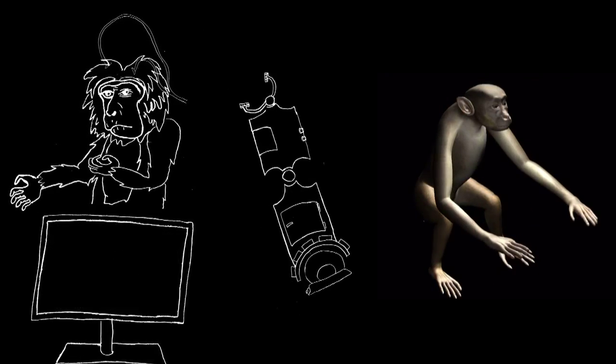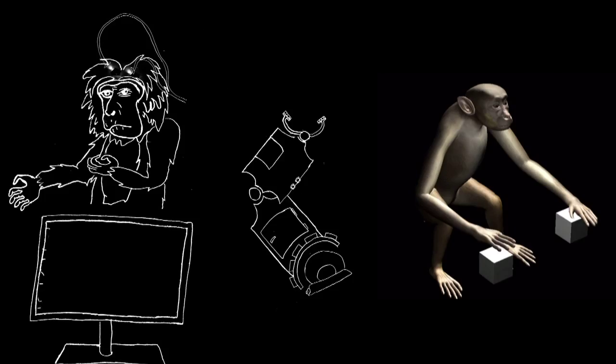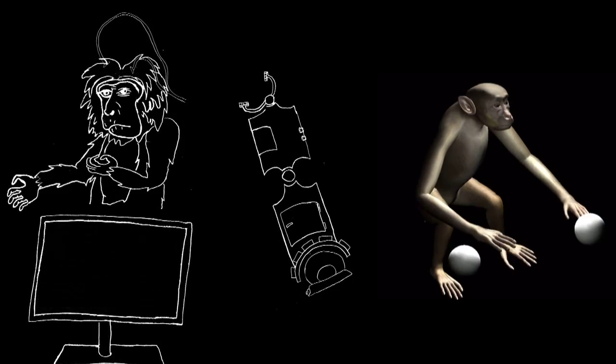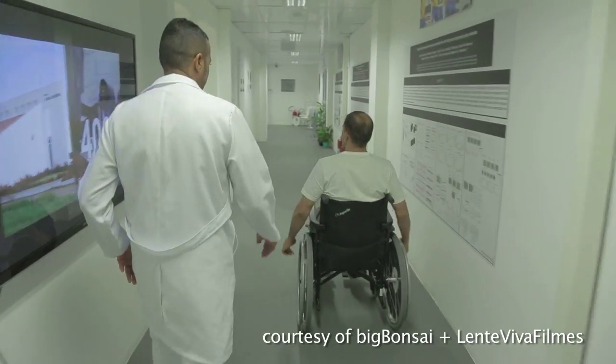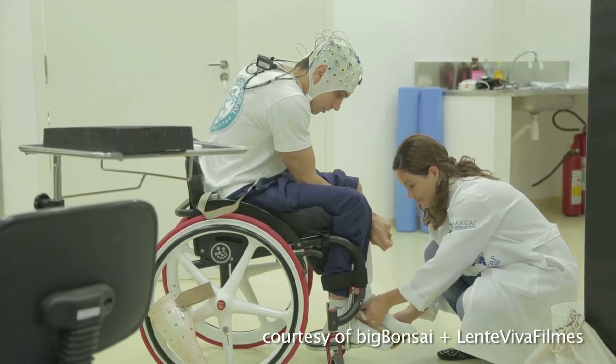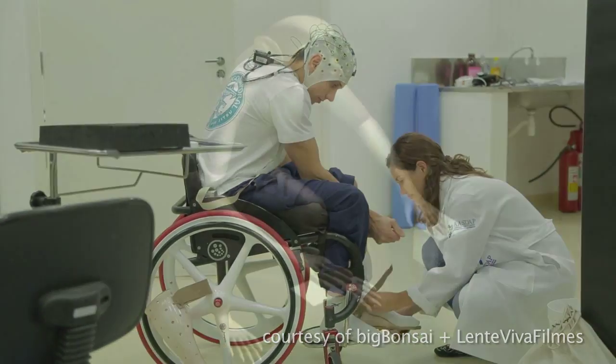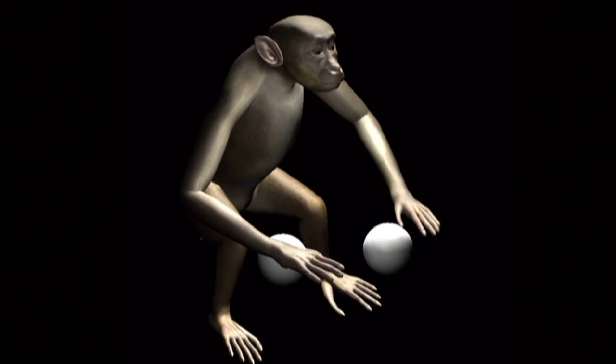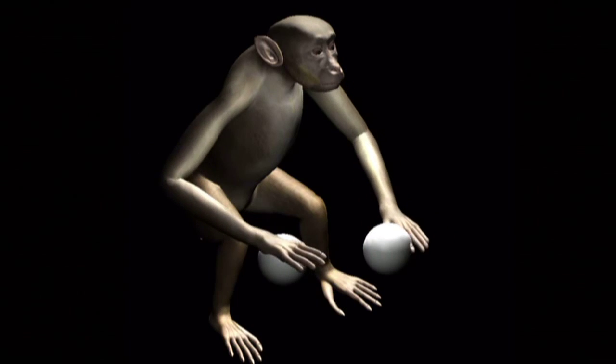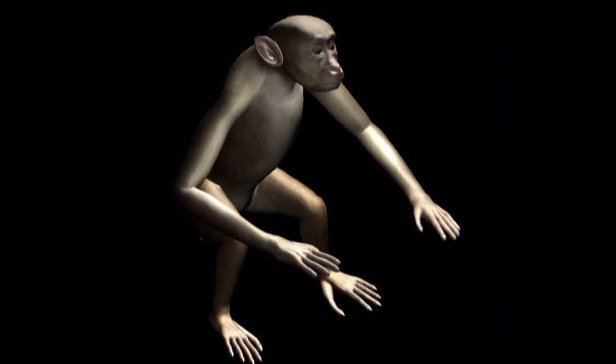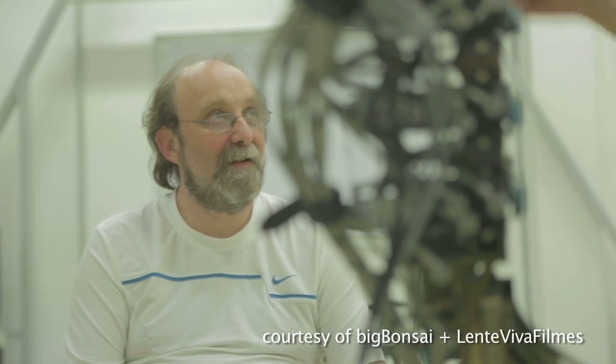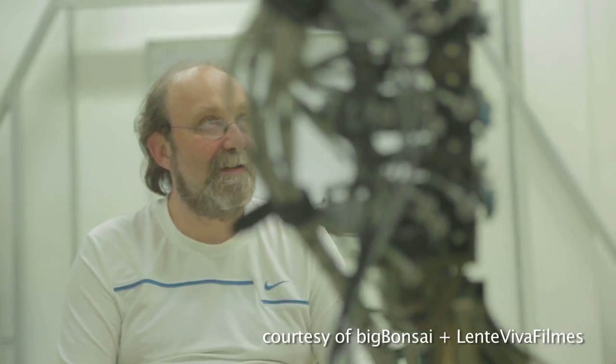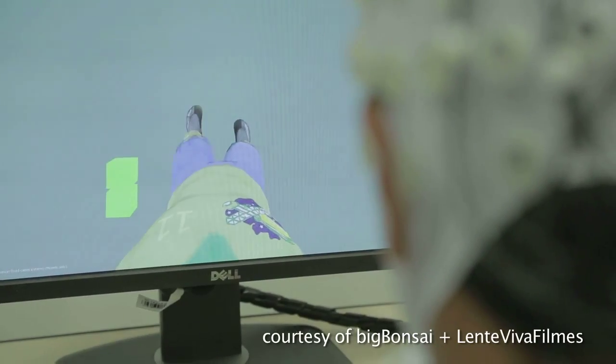Because paraplegics can't physically move their legs, this basic research will be essential for Dr. Nicolaylis and the Walk-Again Project's steps forward.